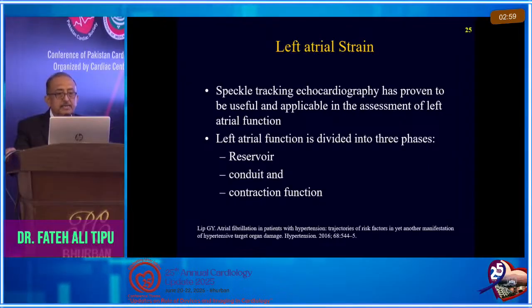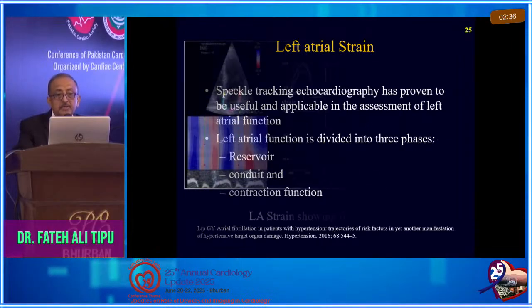Then come to the left atrial strain. Left atrial strain is also important because it signifies the presence of increased filling pressures, or it correlates with LV diastolic dysfunction. Speckle tracking echocardiography has proven to be useful and applicable in the assessment of left atrial function. Left atrial function is divided into reservoir, conduit, and contraction phase.